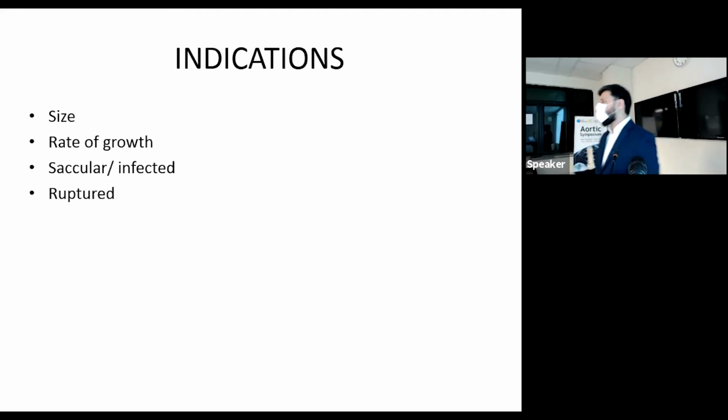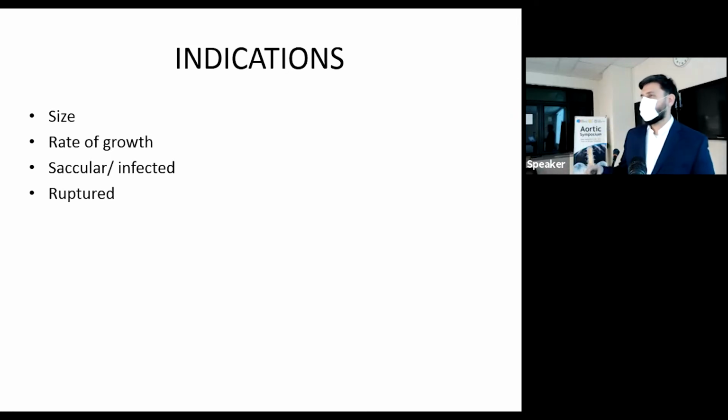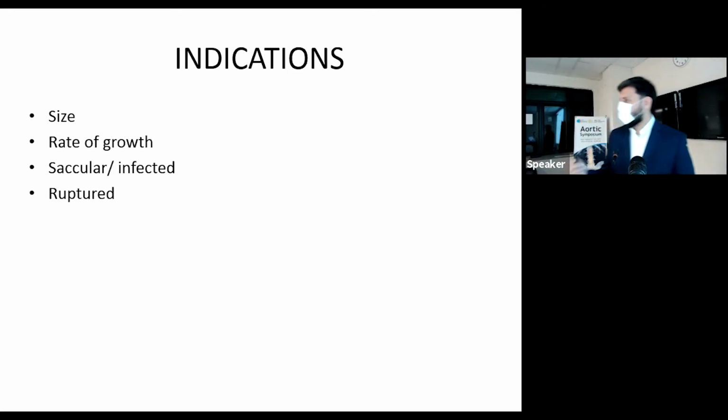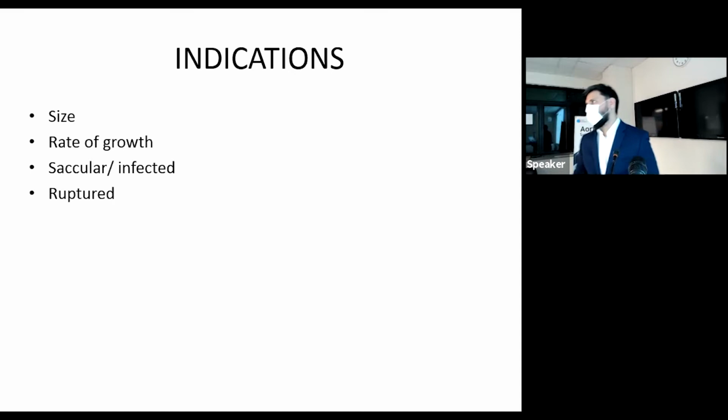And finally, ruptured aneurysm repairs, which is really, I think Dr. Moore was talking about how some vascular surgery cases can be quite run-of-the-mill, and you need that slight thrill to bring back the excitement. And this is where, as an endovascular aneurysm repair person, you really enjoy it, because with ruptured aneurysm repair, you need to think fast, you need to think on your feet, you need to work off the shelf. The problem with that is that we don't have all sizes of stents available on the shelf. They're very expensive. We have to order them in. So it's something we can't offer here at Shifa at the moment, but it's a really interesting space to watch.